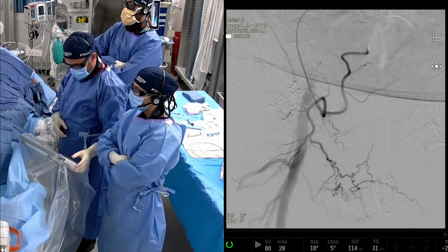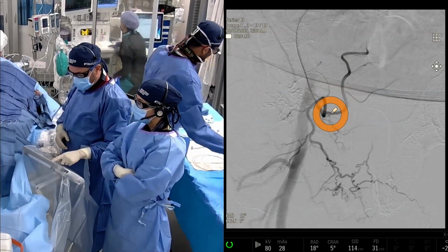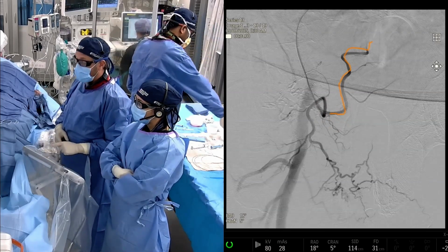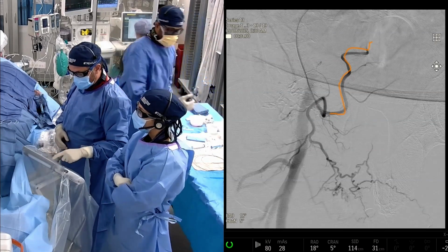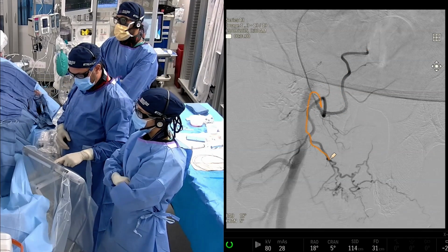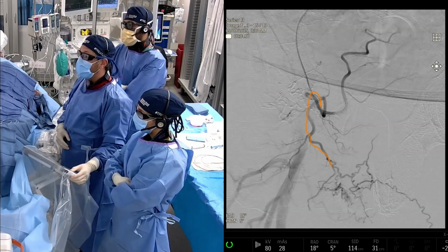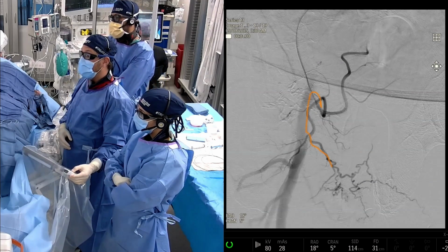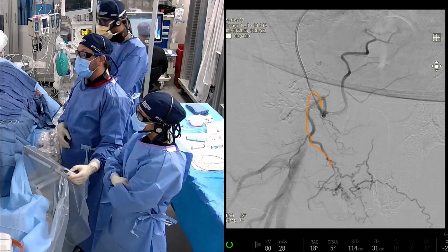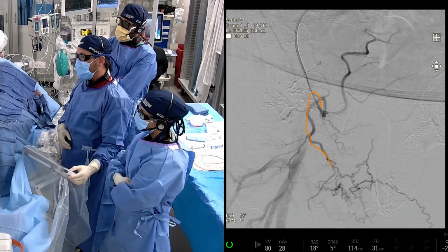So I'm going to draw a little bit on the screen because it's sort of fun. Here's your epigastric right here, going up. We all know this from all the bleeds that we do. Okay, and then this is the corona mortis variant, which shows the obturator coming down and supplying not only the obturator territory, but if you look closely, it's actually supplying pudendal territory. And you can even see the cavernosal artery coming off the obturator here, which is pretty cool. We know that that's significant because the patient had a very diseased pudendal artery. And so that's why we see that.